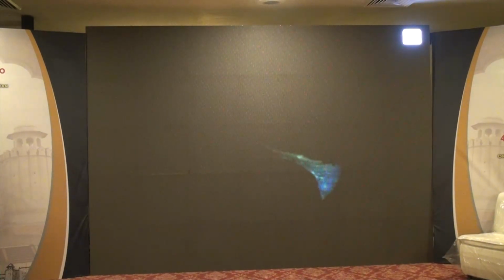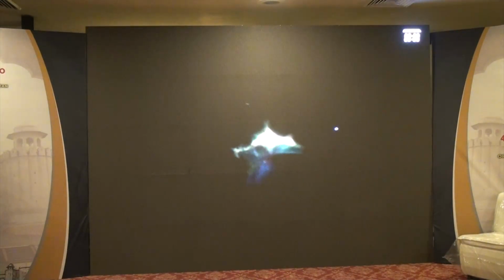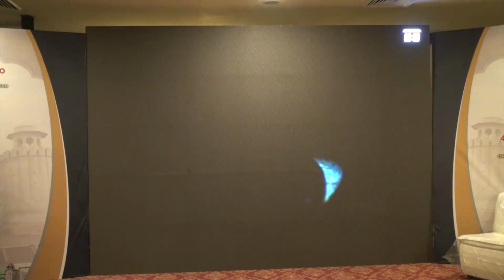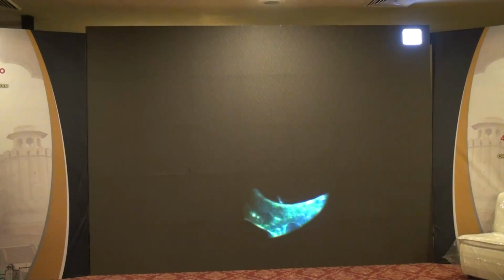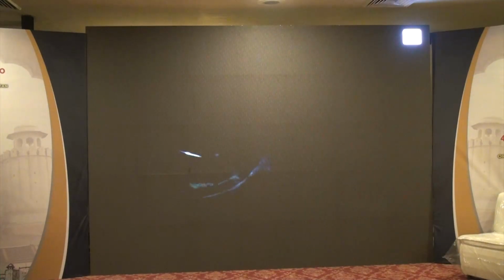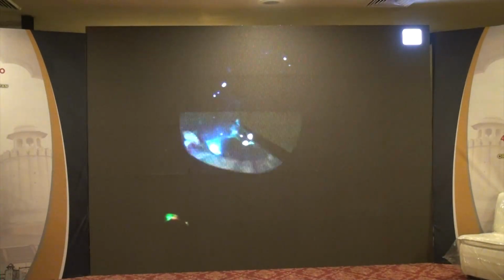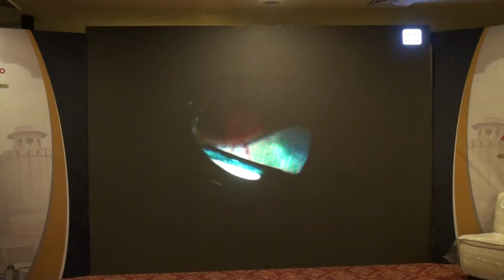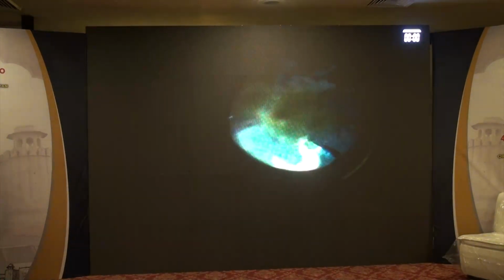So the usual way of dealing with these bands, in order to remove them, you have to do multiple retinotomies. Since there were 5 of them, you have to do 5 retinotomies, and you ensure that the blood vessels are properly cauterized around the retinotomy, so that when you go inside the hole and try to pick up the band, you do not induce any bleeding, because that will go immediately subretinal, and you will not be able to do anything about it.